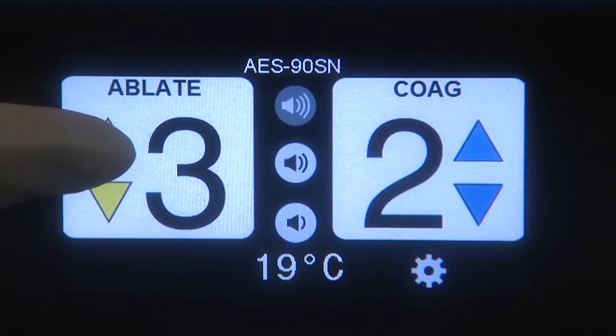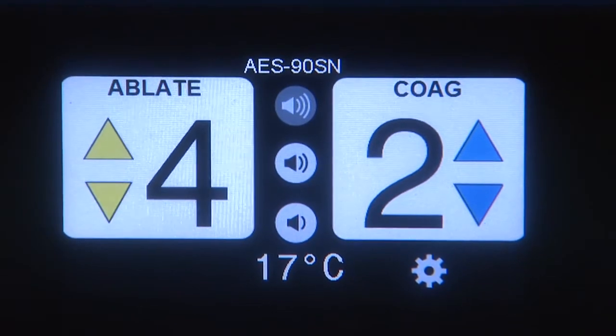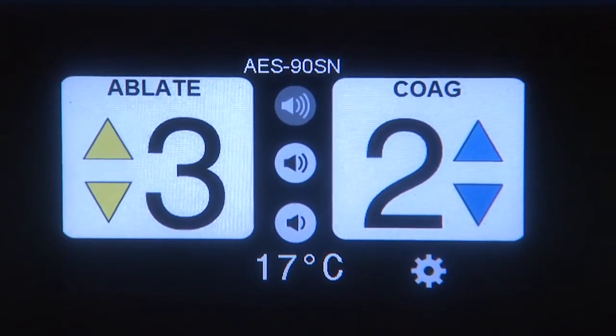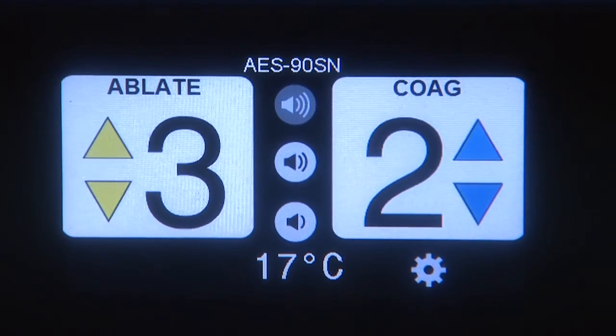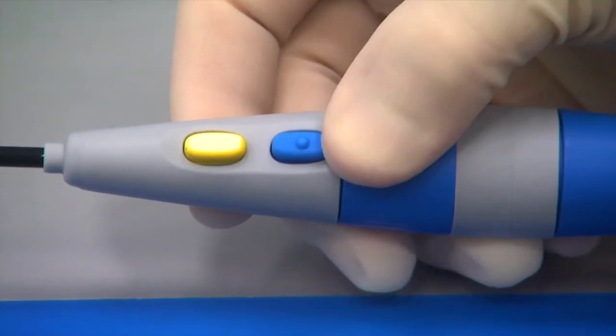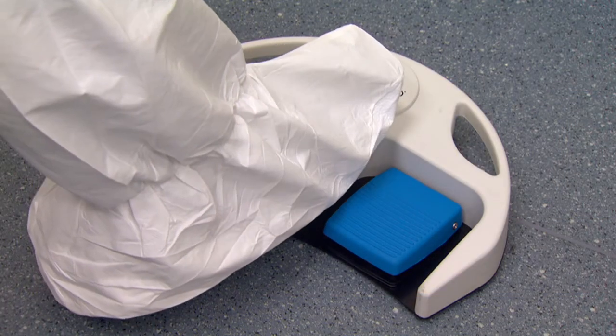Ablation and coagulation power levels can easily be adjusted using the touch screen arrows. The yellow arrows adjust ablate and the blue arrows adjust coag. In addition, the ablate power level can be adjusted by tapping the gray button on the bipolar probe or the black button on the foot controllers.